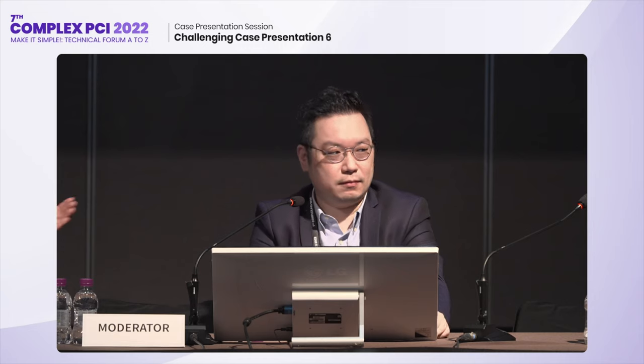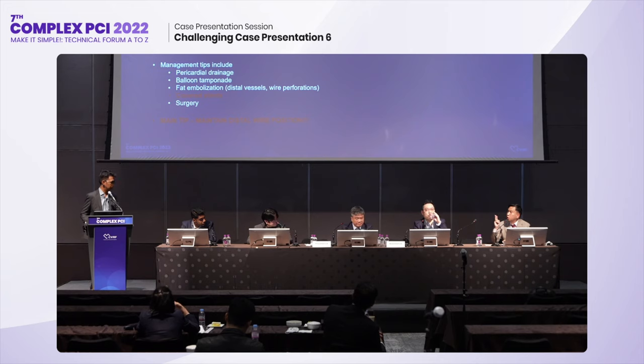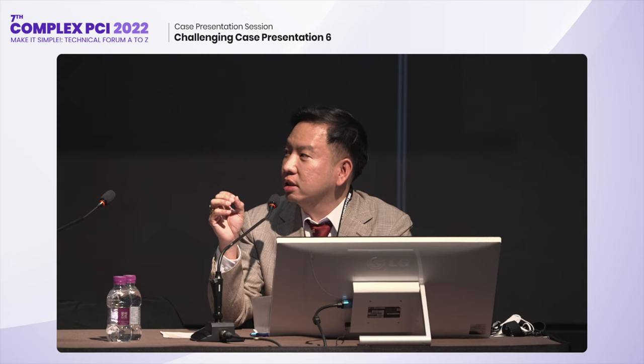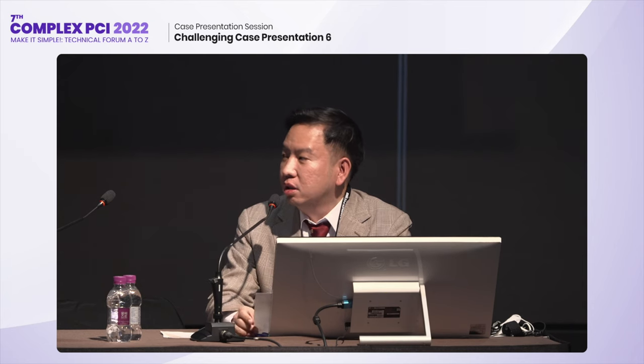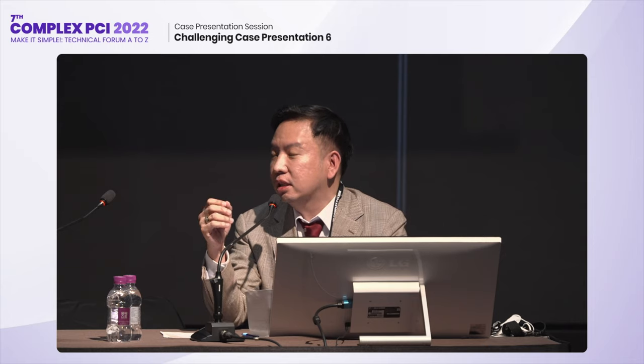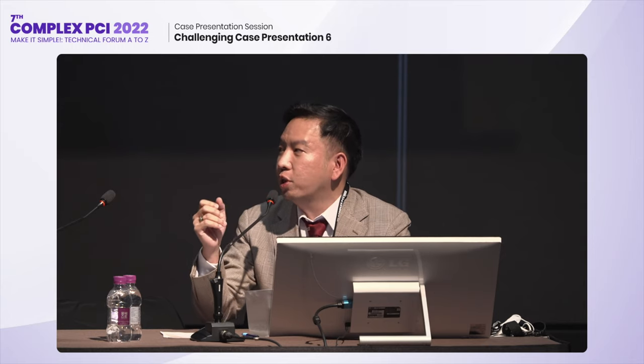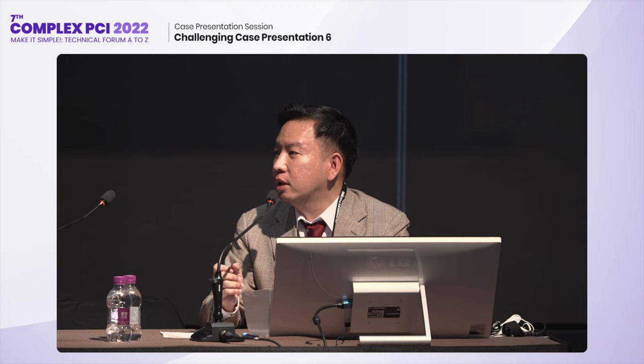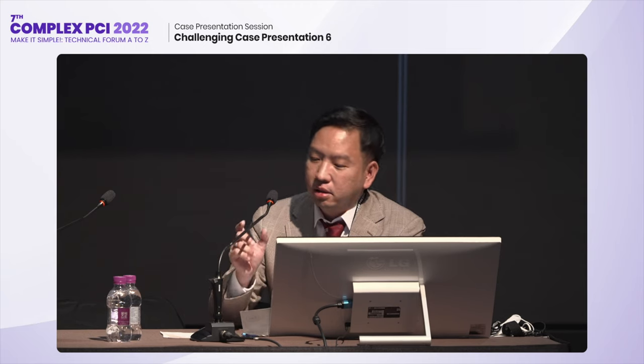In this case, you put in two covered stents, a very long covered stent, and the heart is not good. They are on hemodialysis. So they have a chance of stent thrombosis of the covered stent in the future. Correct. So I think you should escalate the antiplatelet therapy to a more potent one, and maybe the duration should be longer than 1 year. And you should educate the patient about compliance. Yes, I think rightly so. That was the main concern.